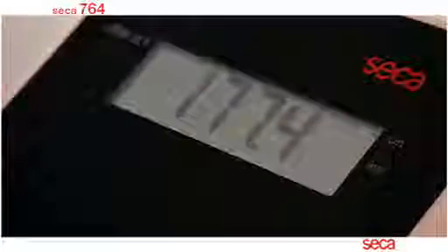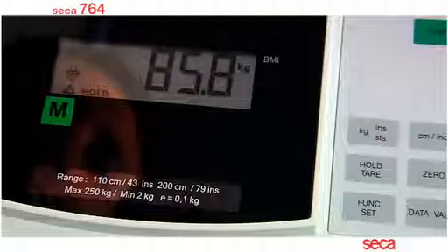The correct height of the patient is important, as both height and weight measurements will be used by the CECA 764 to automatically calculate the body mass index.